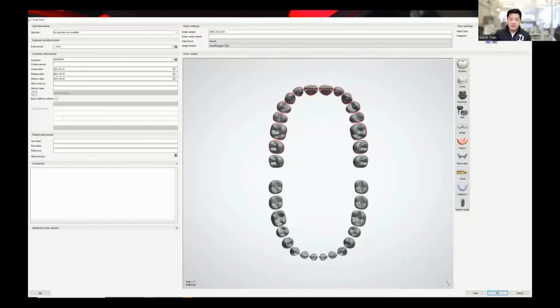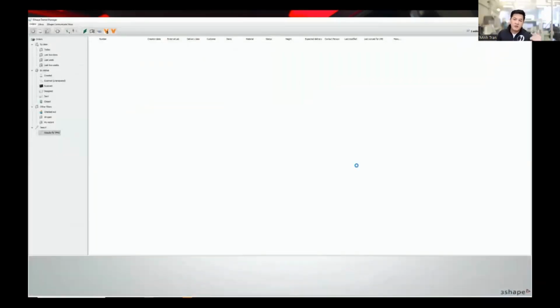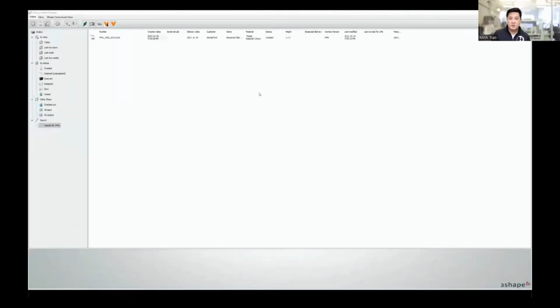So of course, now you're going to select your teeth. Typically, I'm doing a full arch on all of these. So you'll select all the teeth by shift clicking, going to temp on prepared model, bridging all these teeth together, and of course making sure that you're able to select a model that you can build. At this point, if you've already scanned your models and you're switching from a scan model to a digital impression, it may ask you if you want to rescan. I hit no, then just hit OK and proceed through. And then now we go ahead and make our smile.